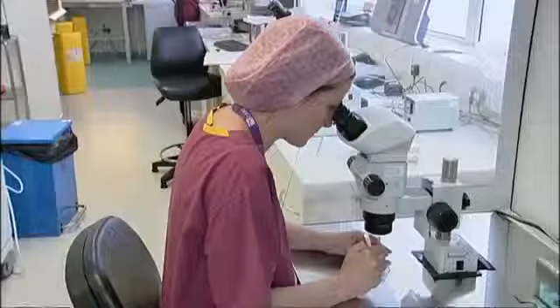And this is what an embryo developing looks like. The ones that develop the fastest over 3 to 5 days are least likely to have abnormalities. We used to take the embryos out once a day and have a look at them. So we had 1 image in 1 day, 5 images in 5 days. Now we have this amazing, if you like, super incubator that is a closed system. It protects the embryo, it's non-invasive, you never have to disturb it. And over a 5-day period, with the microscopes inside this incubator, will give us something like 5,000 images.